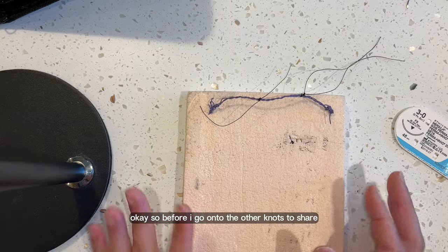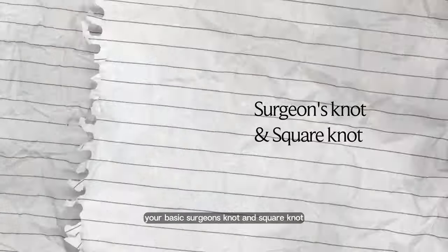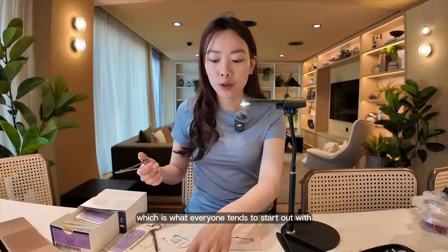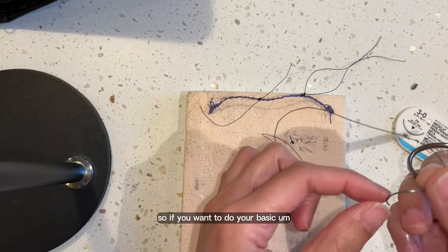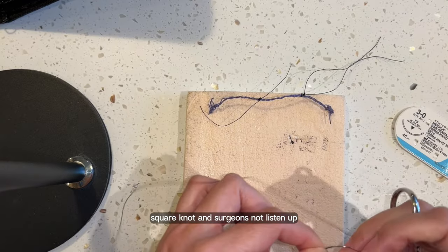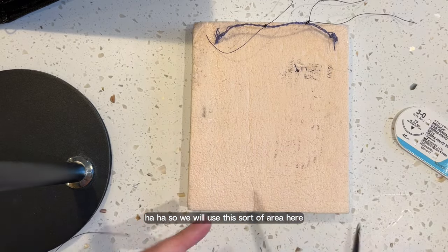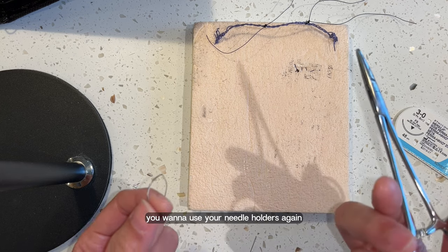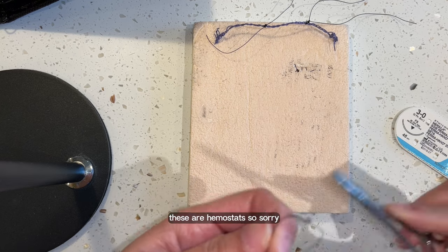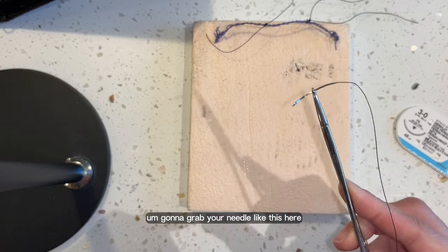Before I go on to the other knots to share, I should probably do a recap on your basic surgeon's knot and square knot, which is what everyone tends to start out with. So if you want to do your basic square knot and surgeon's knot, listen up. We'll use this area here and basically just tie a knot using needle holders — or hemostats in my case. You're going to grab your needle like this.